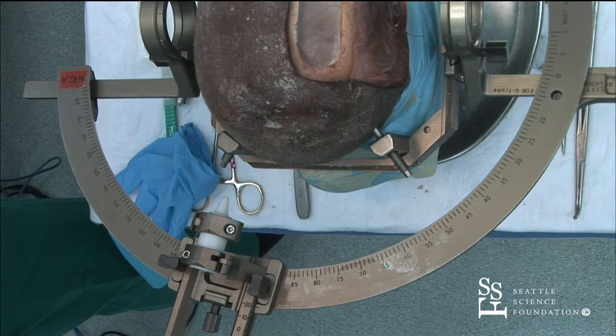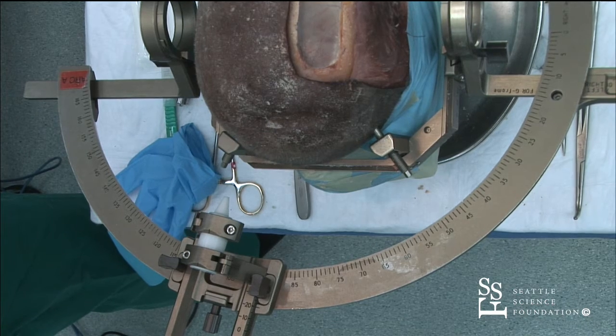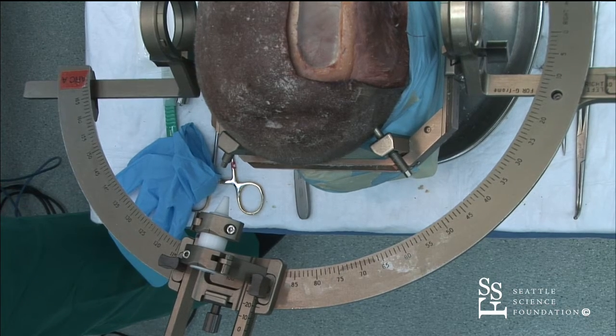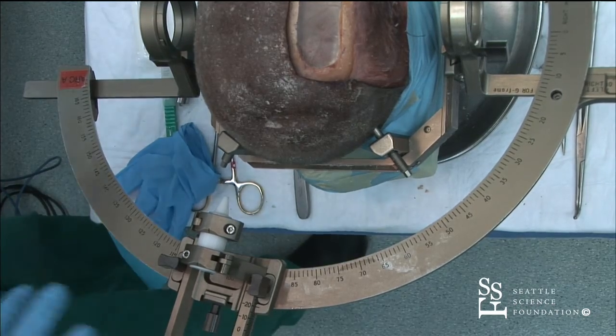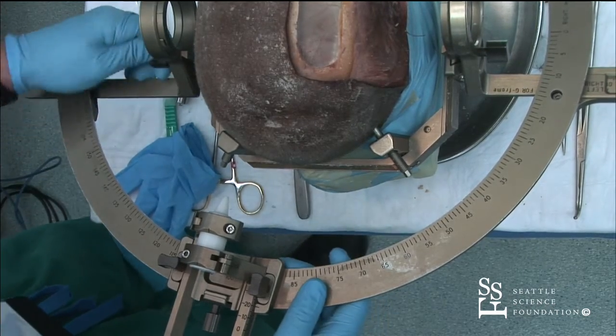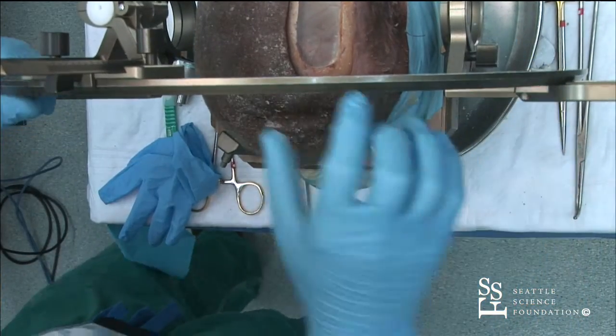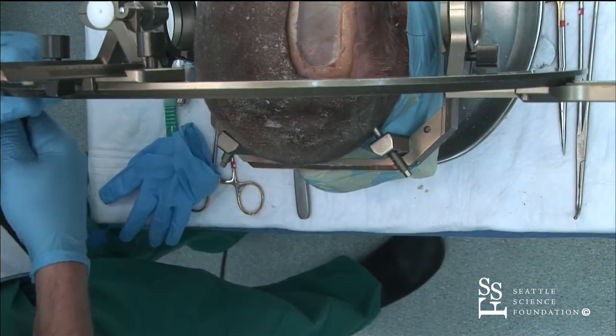Okay, so we find our arc settings then, and you can see here we have lateral is right for our Lexel arc. And you can see we have X 121, Y of 101.3, and Z of 117, ring of 166.7, and arc of 100.6. And I've already set those here, so I'm just going to swing this out of the way now. And actually, I'm going to demonstrate.